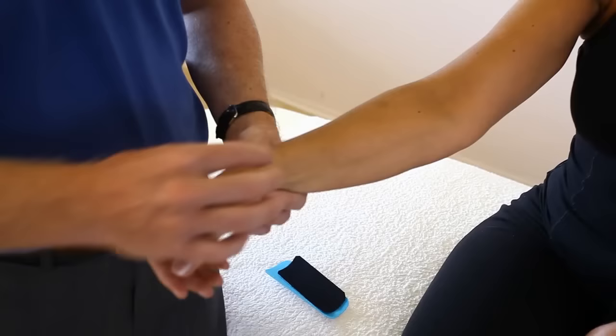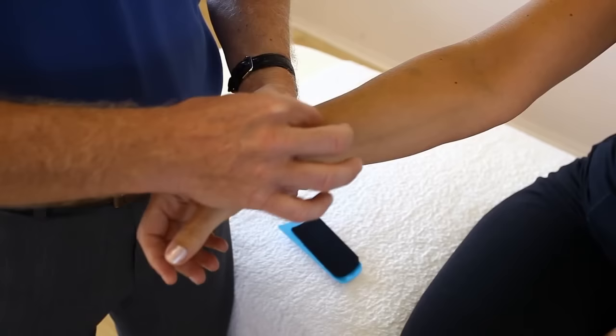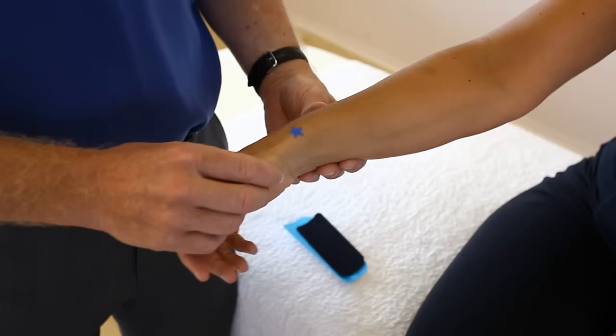Next we are going to tape the wrist. I've marked a star on the wrist so the patient presents with thumb pain and even pain coming up into the forearm. From the thumb there are a couple of tendons coming up through here, and if a patient has pain I've indicated it with a star. So we'll be using kinesiology tape.